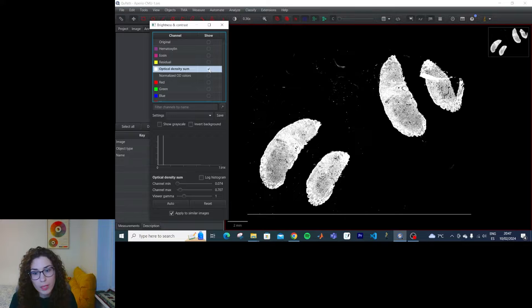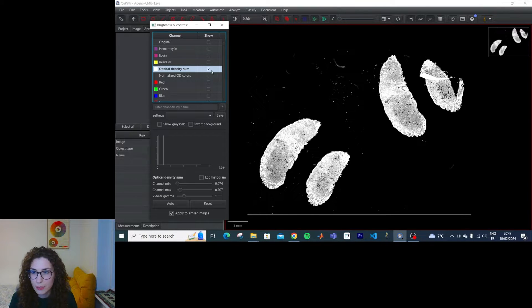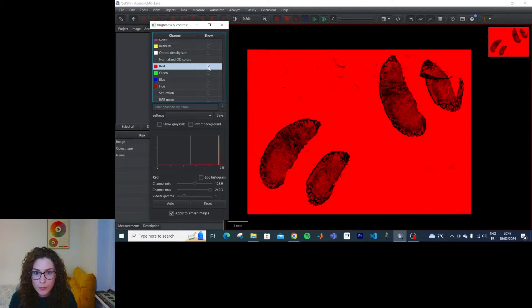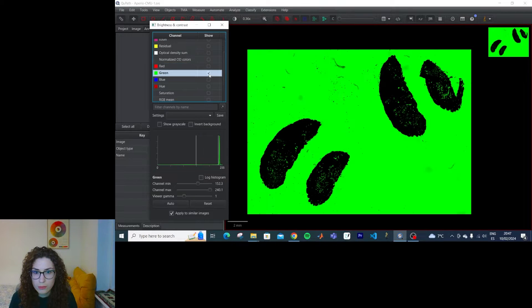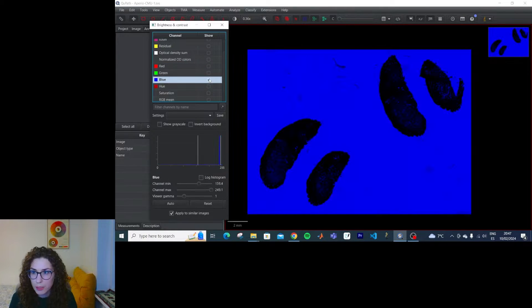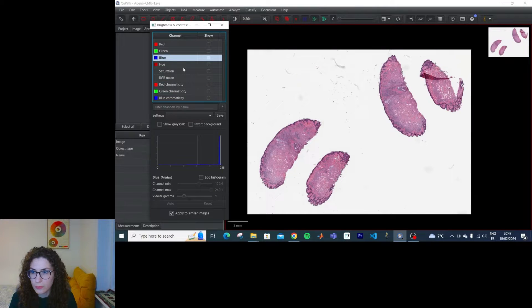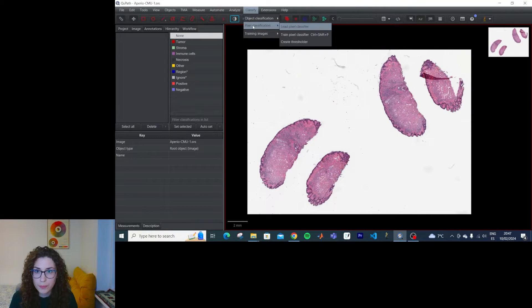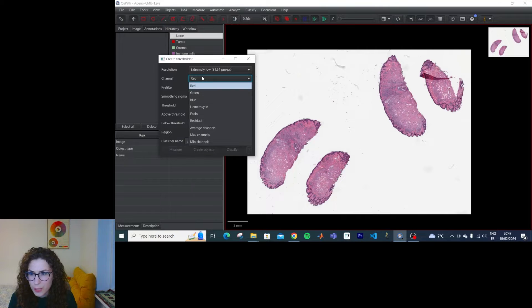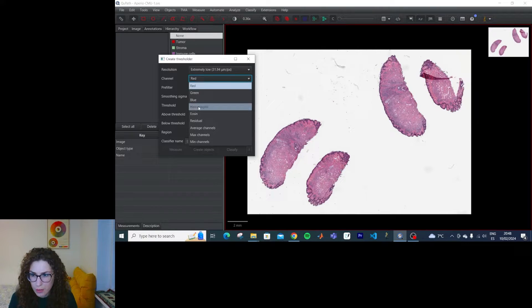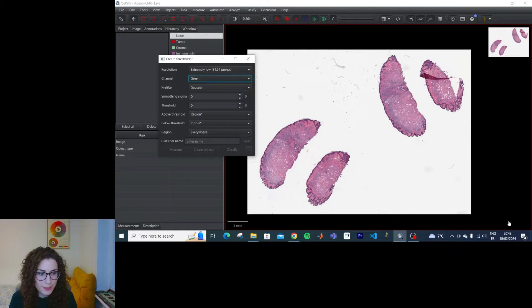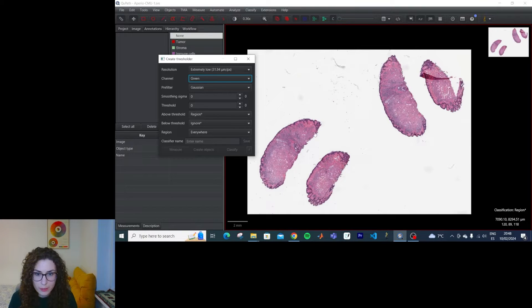Maybe, but you still get a lot of things in the background. Green might be useful. Let's try green. And then since we can, in the lower right corner, see the values of green.